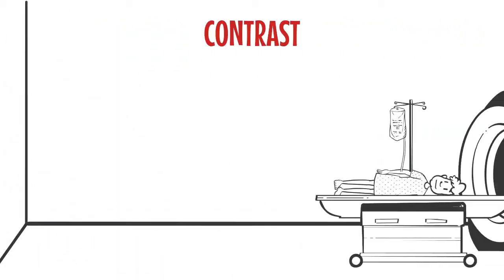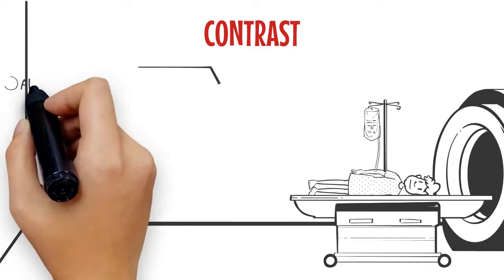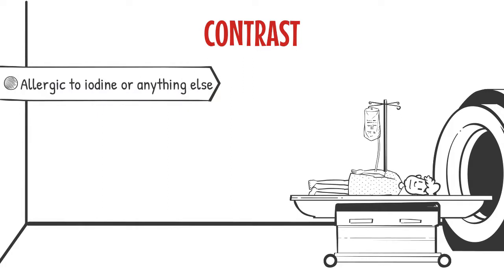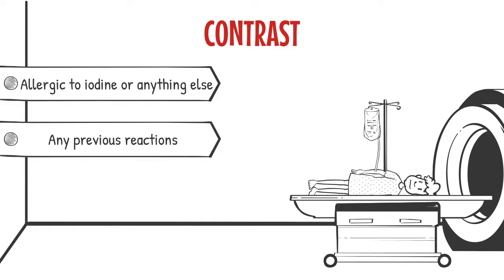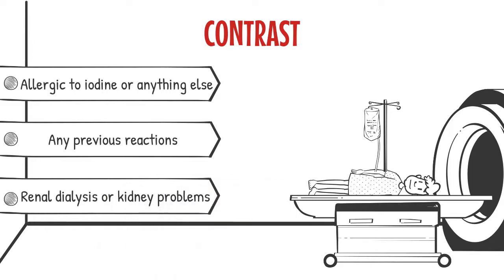The contrast agent contains iodine and is excreted in your urine by the kidneys. Please tell the CT staff on arrival if you are allergic to iodine, have any other allergies, or suffer from asthma. If you have reacted previously to any intravenous contrast agents, the dye used for kidney x-rays and CT scanning, or if you're on renal dialysis, have any problems with your kidneys, or are seeing a kidney specialist. You may feel warm and potentially sick during the injection, but this should pass in 1 minute.